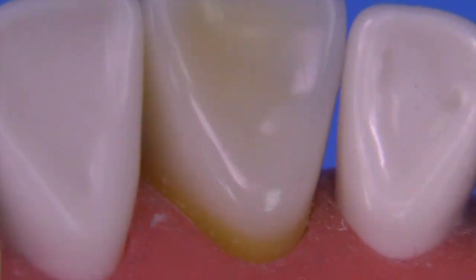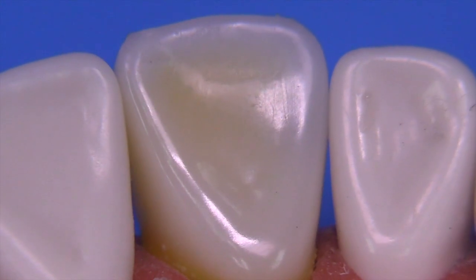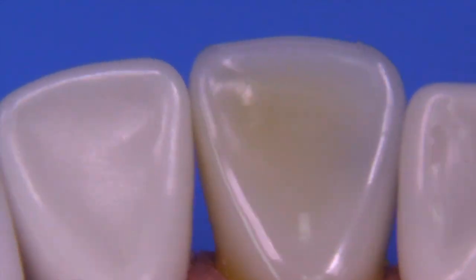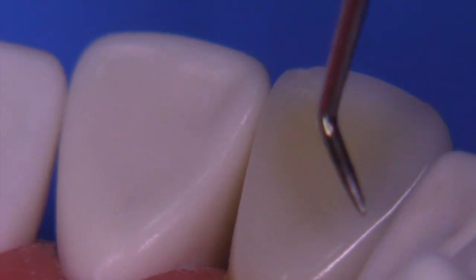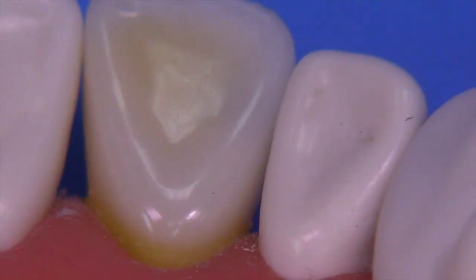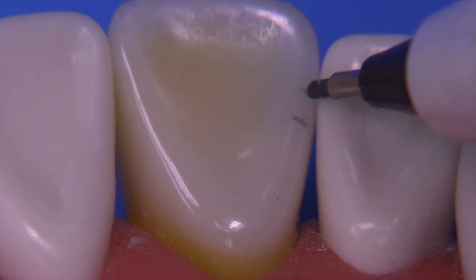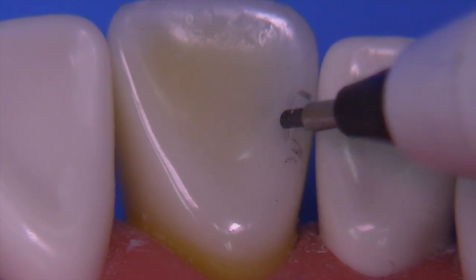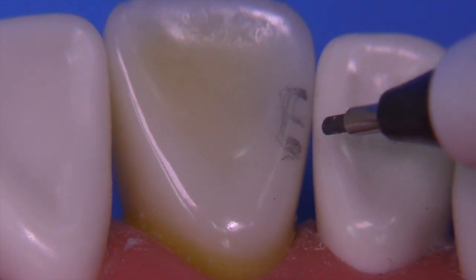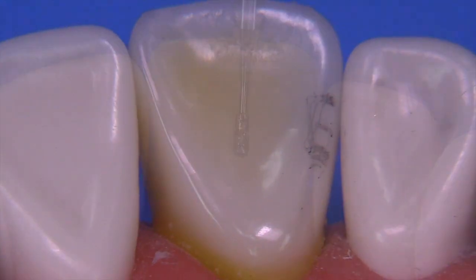When you perform a class 3, you typically do not break the incisal contact. You will definitely break the gingival contact and most of the facial contact, but not the incisal contact. Caries is located not in the middle of the contact area but slightly gingival to the middle of the contact. Your preparation is going to be centered from about 0.3 mm below the contact up approximately 2 to 2.5 mm. Don't center your prep in the contact area — this is a big mistake. The caries starts below the contact and creeps up into it.